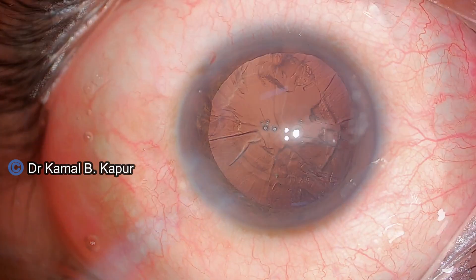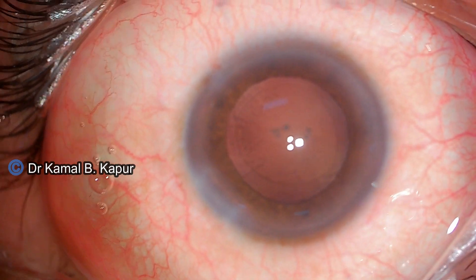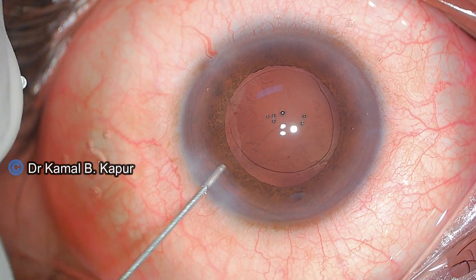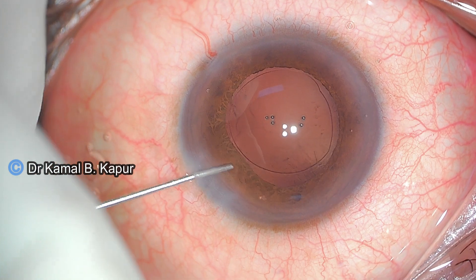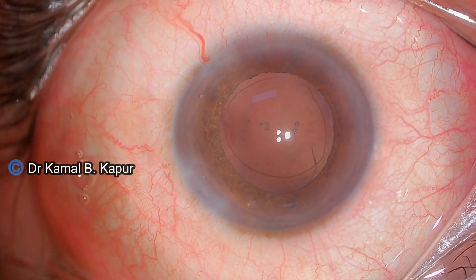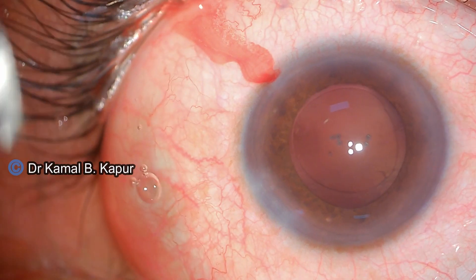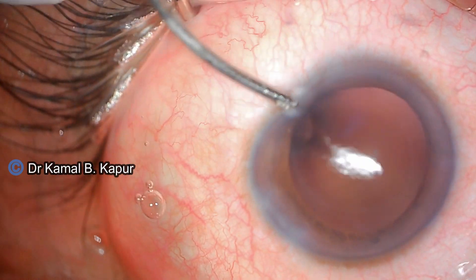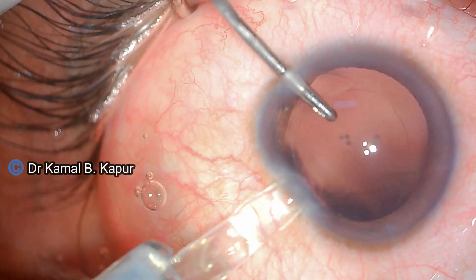As we proceed to remove the crystalline lens, we ensure that when we are making the side ports or the main incision, there should be minimal or no ooze of blood — because oozing blood can get under the gonio lens and cause loss of visibility or blurring of the view of the angle and its structures.